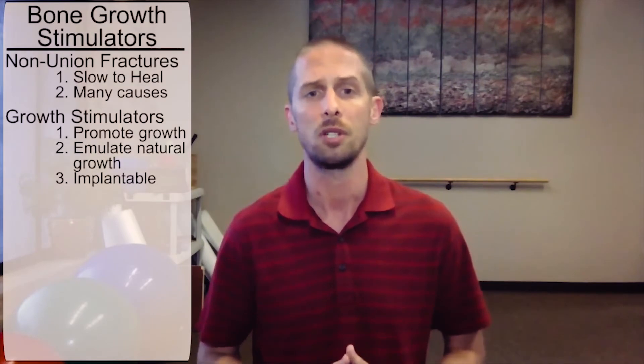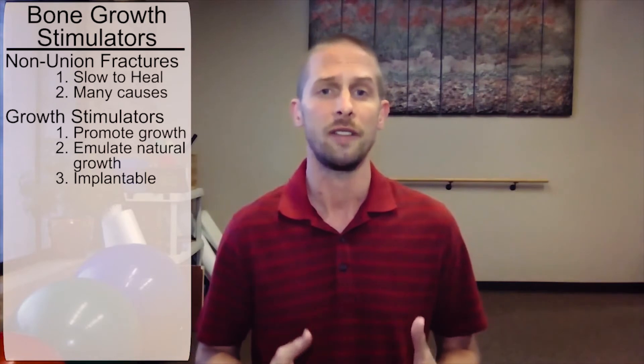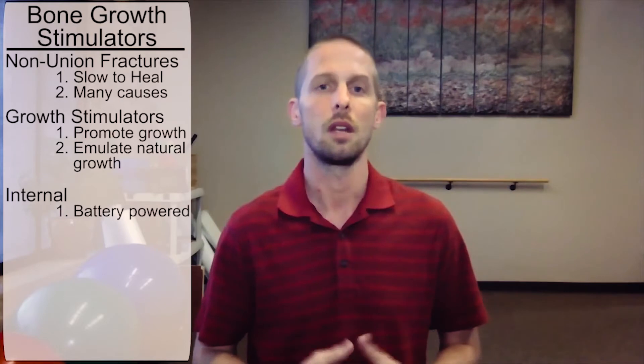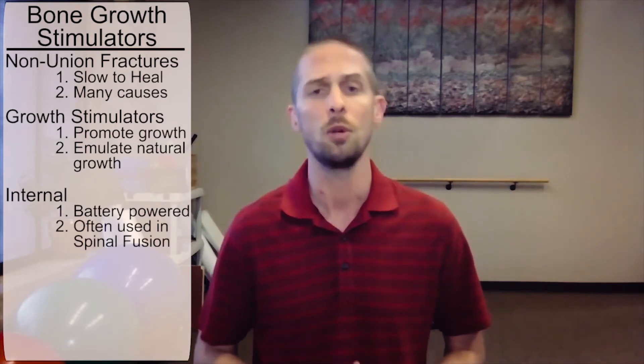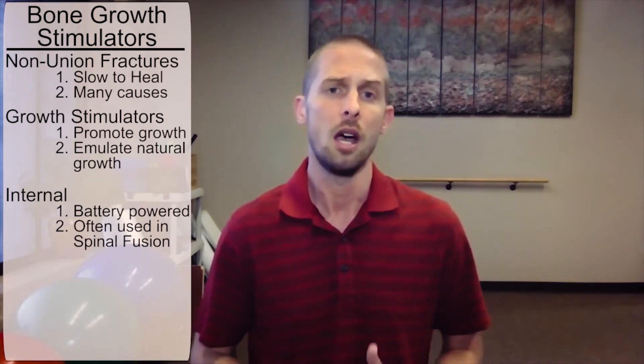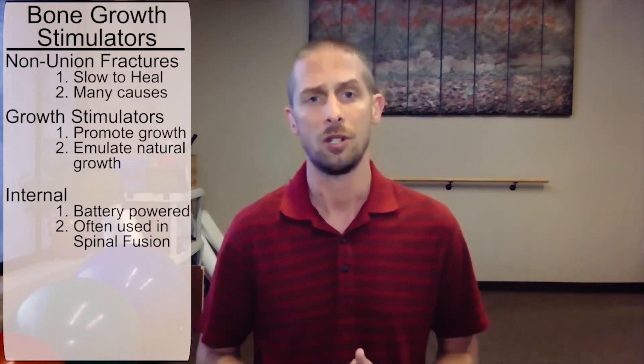With internal stimulators, the device is usually implanted during the surgical procedure used to correct the bone issue at hand. Electrodes are fastened near the bone or bones and connected to a battery pack responsible for the impulses. This type is most common with spinal fusion surgery and is typically removed within 6 to 12 months. The device is quite small and implanted in a soft pocket of the skin in the lower back, right next to the spine, delivering electrical current directly to the area where bone growth is to occur.